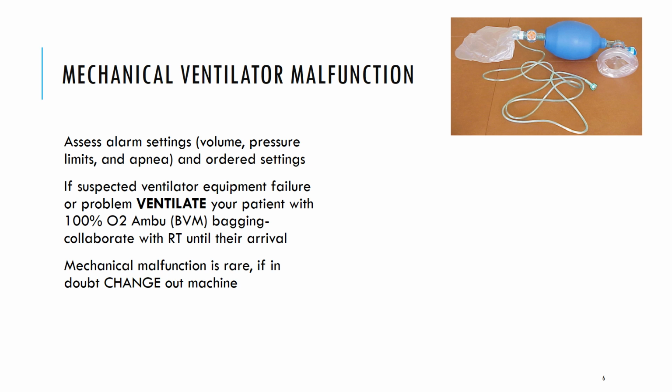And the bottom line is when you walk into the room and notice that the ventilator is not working appropriately, if your patient is stable and the malfunction is not immediately life-threatening, you can take a couple of seconds to quickly make sure all of the settings are appropriate and maybe quickly fix an error. But if there is no immediate solution available, it's time to stop trying to fix the machine and start looking at your patient. You are now the ventilator. So remember, airway and breathing are our priorities, not technology support.